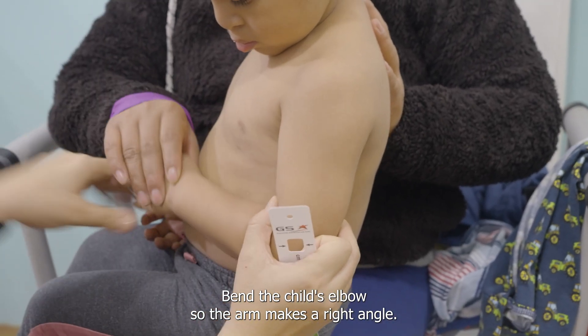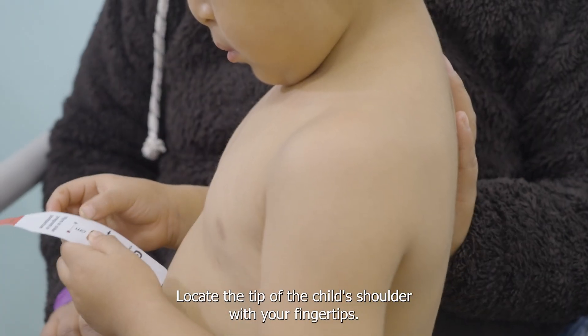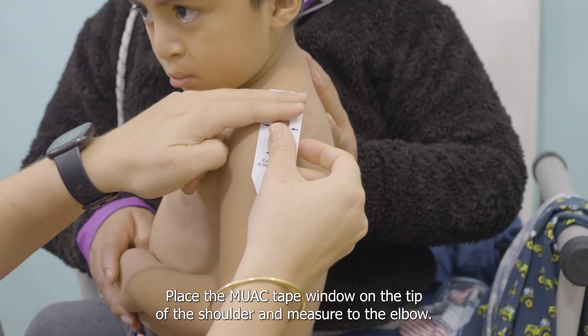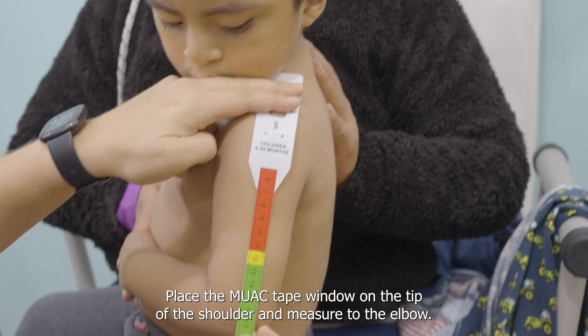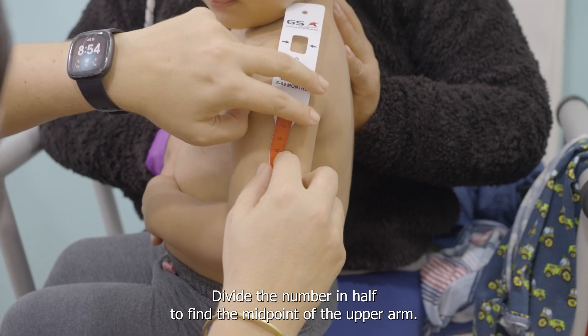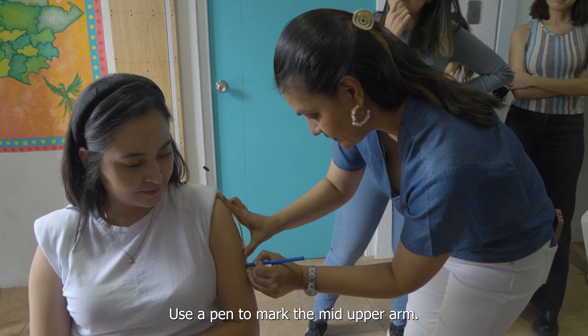Bend the child's elbow so the arm makes a right angle. Locate the tip of the child's shoulder with your fingertips. Place the MUAC tape window on the tip of the shoulder and measure to the elbow. Divide the number in half to find the midpoint of the upper arm. Use a pen to mark the mid-upper arm.